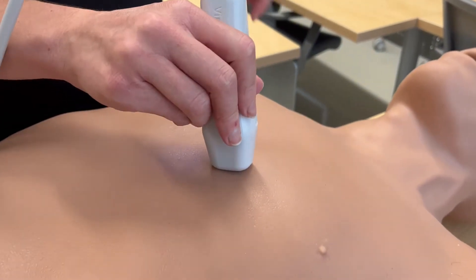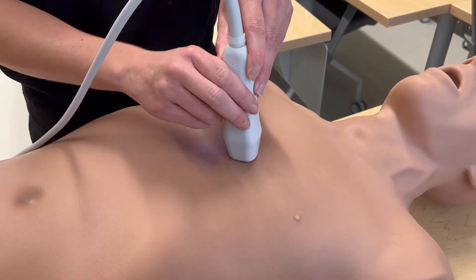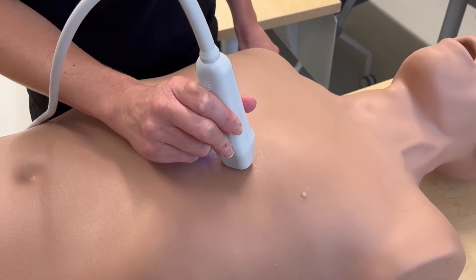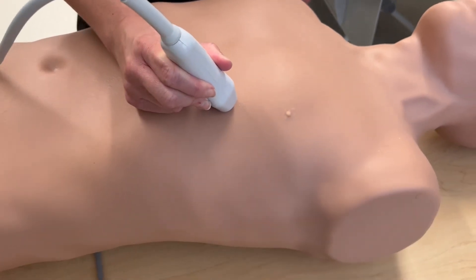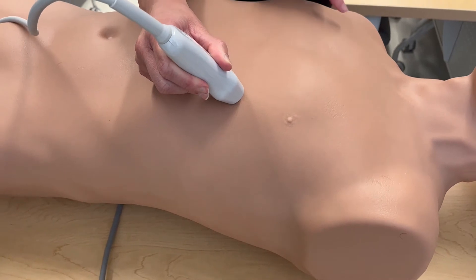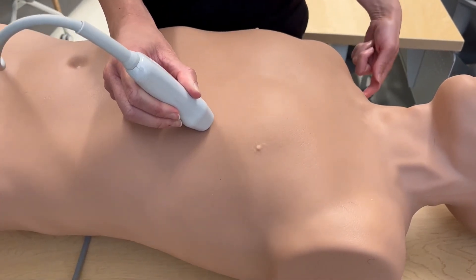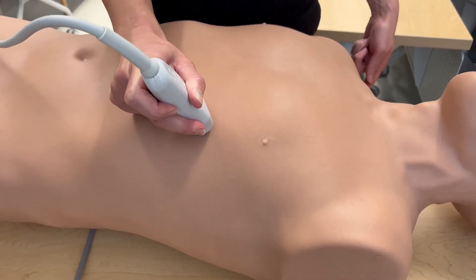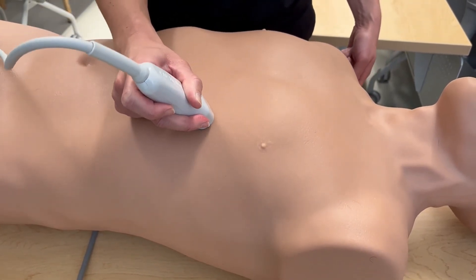The next view in our echo is the apical four-chamber view. We're going to keep the probe in the same orientation, with the probe marker still pointed towards the patient's right hip, and slide the probe laterally on the patient's chest. In the apical four-chamber view, we're trying to have the probe at the apex of the heart, looking back up at the heart, so the ultrasound is scanning towards the patient's right shoulder or right scapula. If scanning on a patient with breast tissue, you'll need to be underneath the breast tissue to obtain this view.